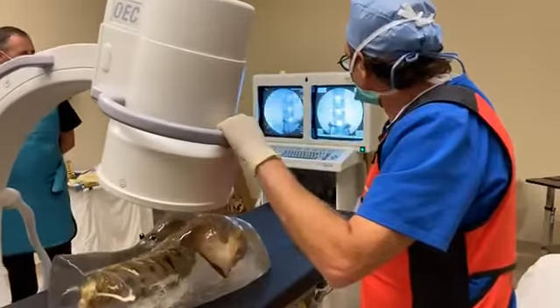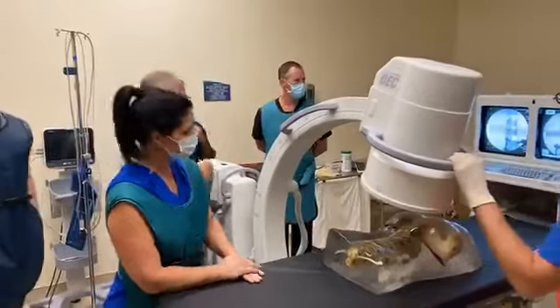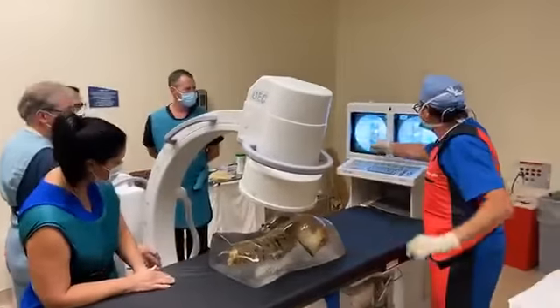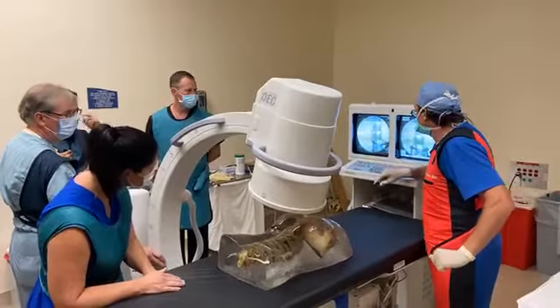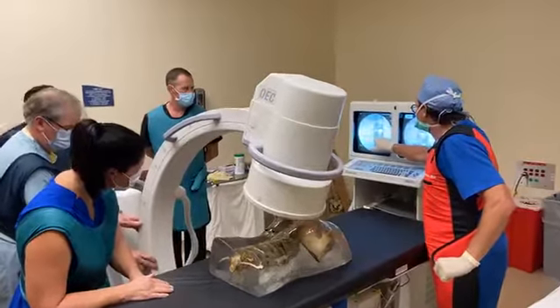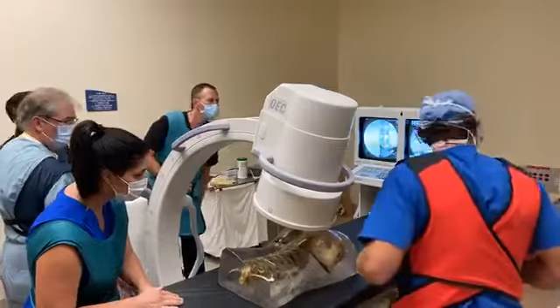So, Jennifer, I like to call this the universal injection view. On this view, you now see the facet joint. You see the needle on the medial branch. If you want to do a nerve block, you would put the needle underneath the pedicle.